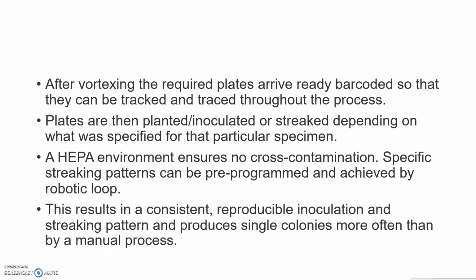However, robotic technology is most common. This results in a consistent, reproducible inoculation and streaking pattern, and it produces single colonies more often than a manual process. The manual process is very time consuming, so nowadays most of the labs have converted to automation.